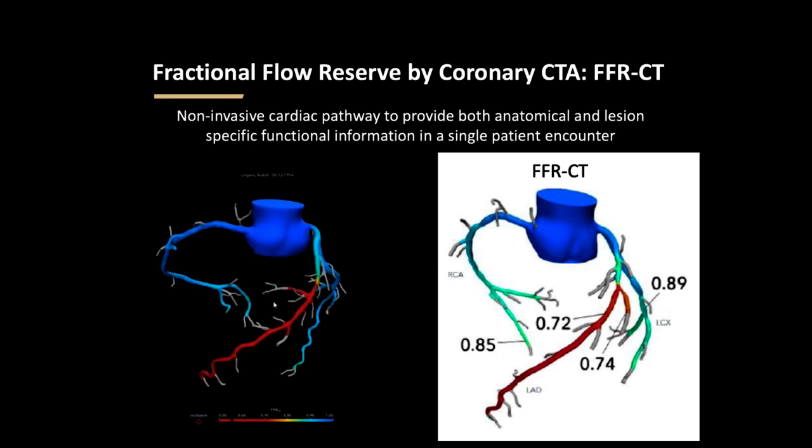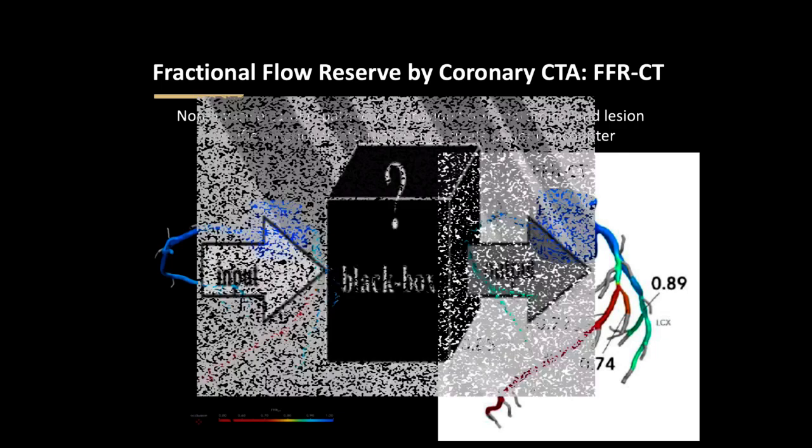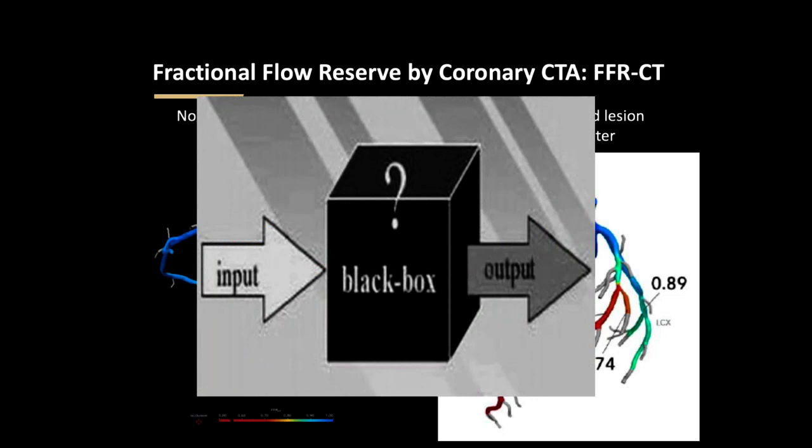So if you have a CT image, you would send your study out to the Bay Area, to HeartFlow, and within 5 hours they would send you back a pretty 3D model of the coronary tree, and you'd be able to manipulate it and determine if a particular stenosis is positive in terms of the FFR. There's been some preliminary data showing improved accuracy when you add FFR to standard coronary CTA imaging. But at this point, in terms of how we do it, it's still a little bit of a black box. We're sending them the images, and we're getting back this FFR.